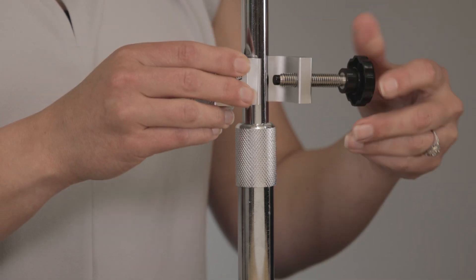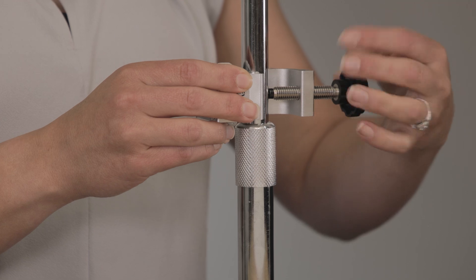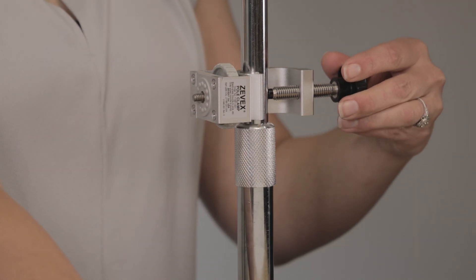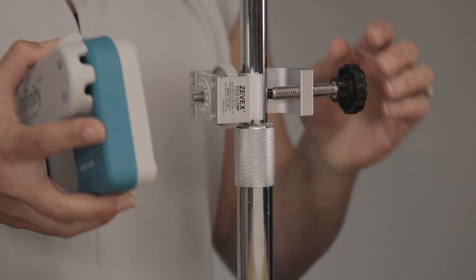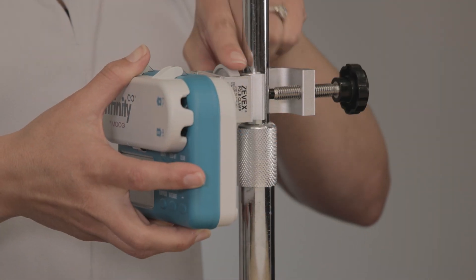If you are using an IV pole clamp, first attach the pole clamp to the IV pole by loosening the clamp so that it fits onto the pole and then tighten. Then attach the pump to the pole clamp by aligning the pole clamp bolt with the receptacle on the back of the pump and then tighten the knob.